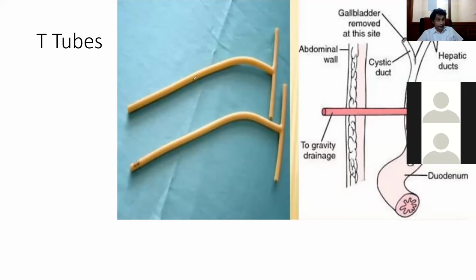If you leave the tube for a very long time, right? Some people, sometimes you can pull the tube out and put a small endoscope along that pathway and have a look also. That is done sometimes. But to do that, you have to take the tube out. No, once you take the tube out, you can't put it back in. So if you want to see whether there's a stone, the most sensitive, most accurate way is to do a T-tube cholangiogram. If you find a stone there, sometimes you can put a scope or something along the path after taking the tube and use that endoscope to break the stone or do something like that. But to diagnose a stone in that, the most accurate way is the T-tube cholangiogram.